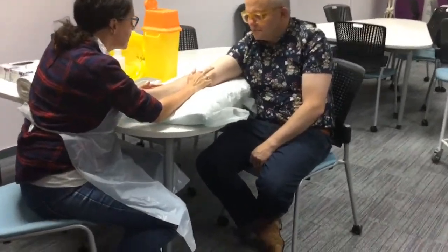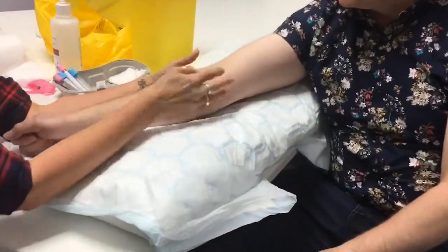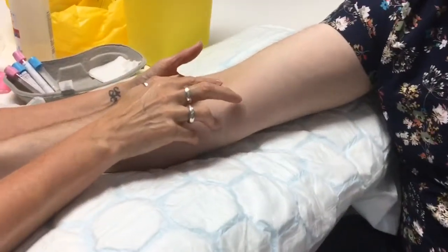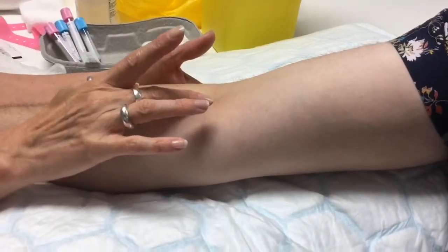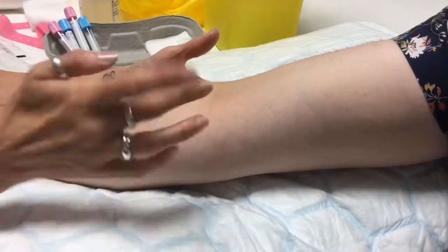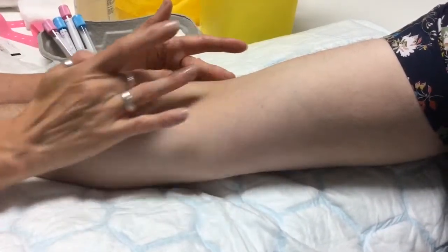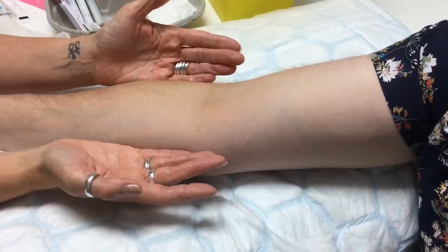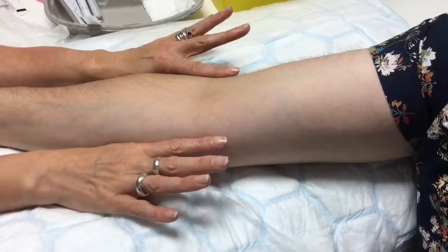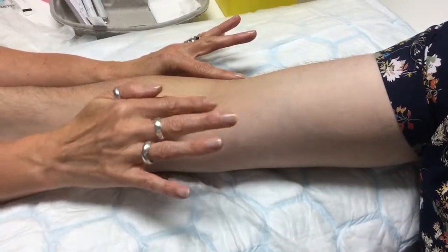With the vein, it's important that you can not just visualise it but actually palpate it — press down and you should feel it rebound back. We have one there. By the time I put the tourniquet on, that will come to the surface more. I'm going to aim to go here. This is the antecubital fossa area — it's important to stay quite medial, in the middle. If you go too lateral down the sides, you can be at risk of hitting some of the nerves.